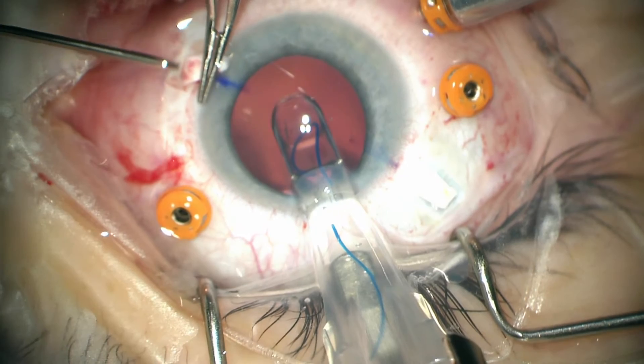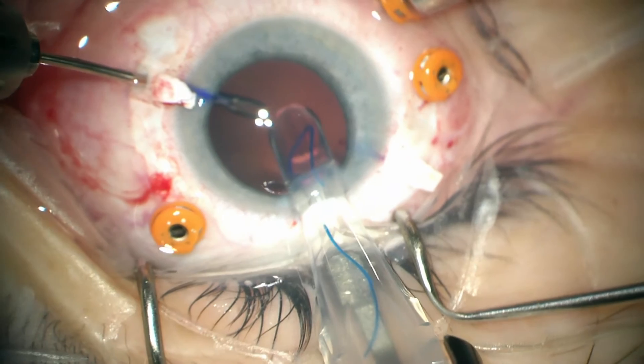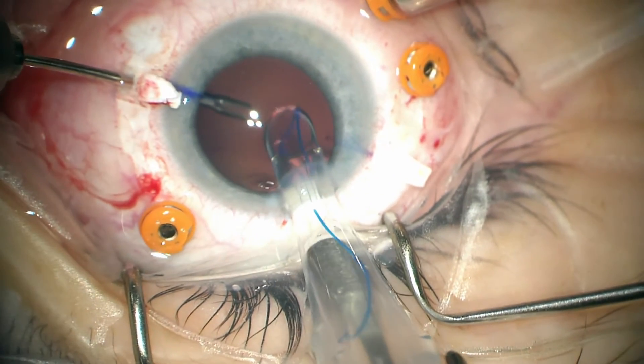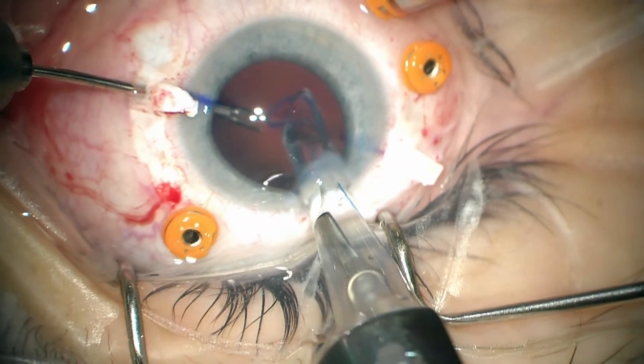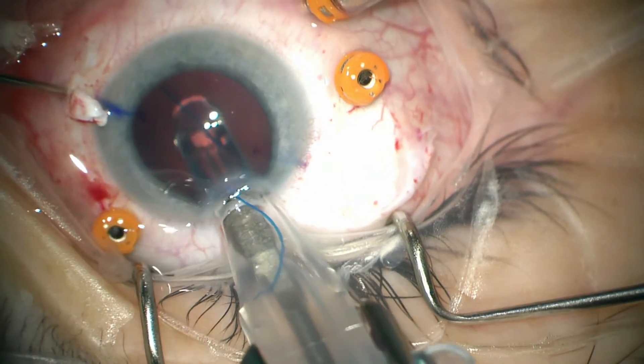As the lens is inserted, an MST Duet forcep is inserted into the eye to grasp that haptic as it comes out of the inserter cartridge. Again, you don't have to be quite as careful with these haptics as they tend not to break or bend as you pull them out of the eye.